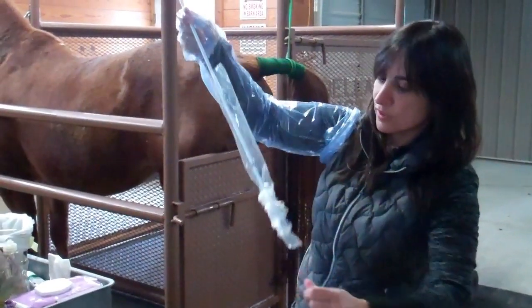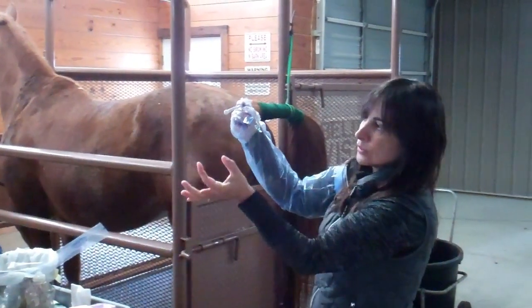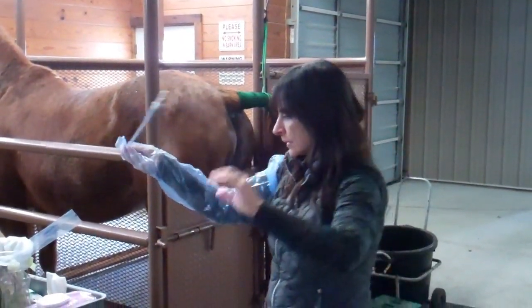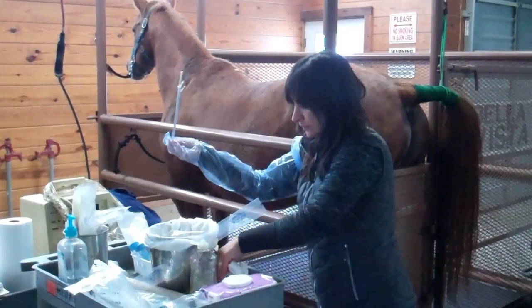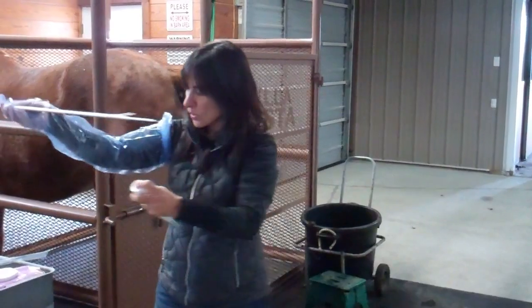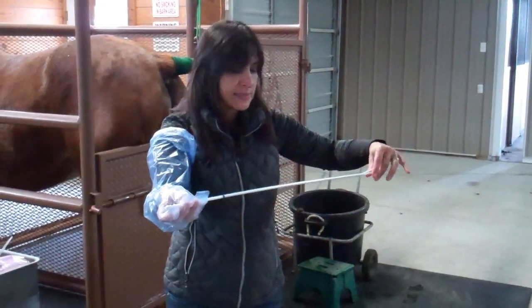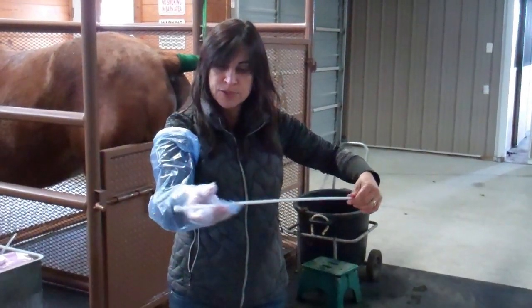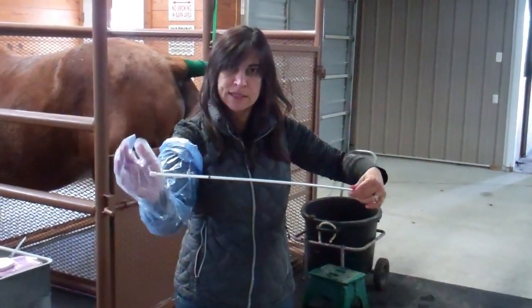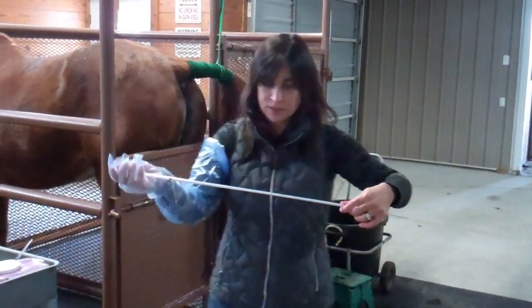This is what we call a double-guarded swab. It has basically two little tubes. Both are sterile, but when I go through the vagina, I keep the swab closed just like this. And once I pass the cervix and I'm inside the uterus, I advance my swab. That way the sample that I take is entirely from the uterus and there is no contaminant of my result.